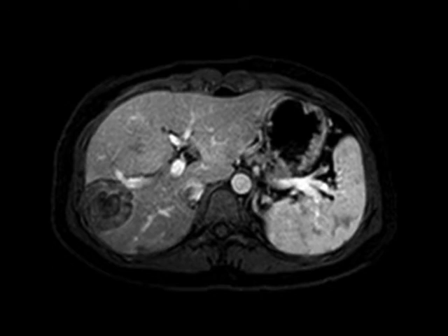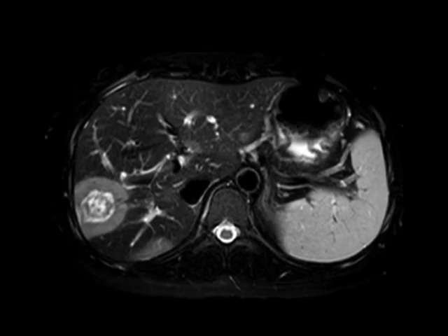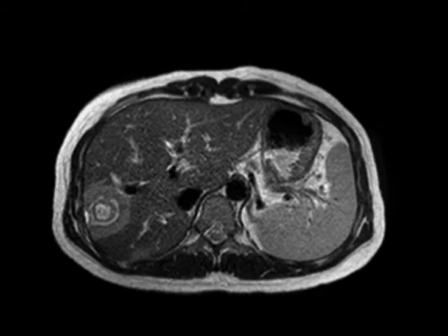Clearly, common things being common, you'd have to think about metastatic disease or maybe even some kind of unusual infection. But when I see that constellation of findings — target-like morphology, multiple peripheral lesions, confluent over time, associated capsular retraction — I'm going to think about a relatively rare diagnosis with a relatively specific constellation of imaging findings, and that's hepatic epithelioid hemangioendothelioma.